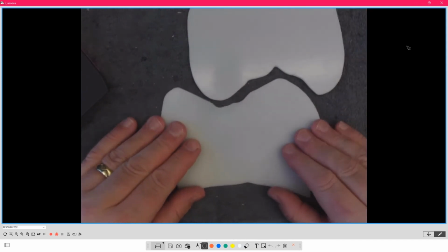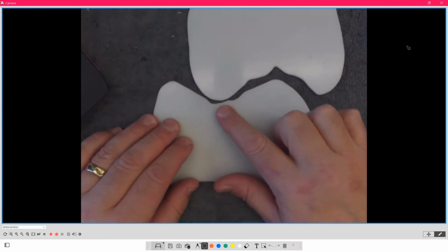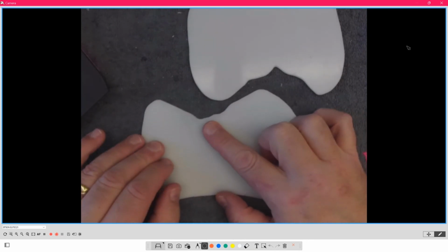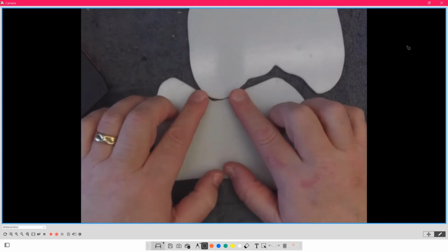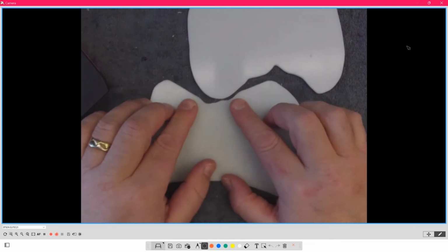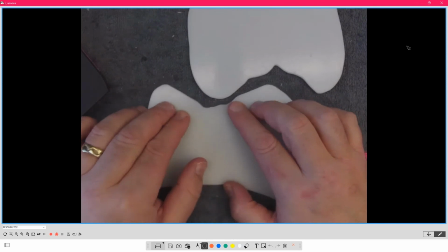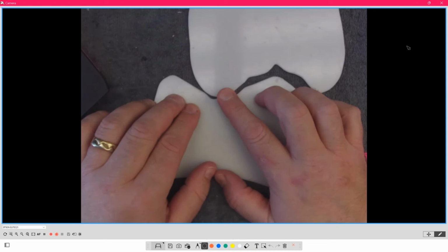That means that they can land in centric because there's a little helicopter pad here to land in. And then it's not going to land and slide into position because the whole thing is locked in, meaning that this fossa is locked against this cusp. There's that little bit of freedom. And that's been the real aha moment, and the kicker here is that they can chew and land in there because remember, they cannot feel their teeth.